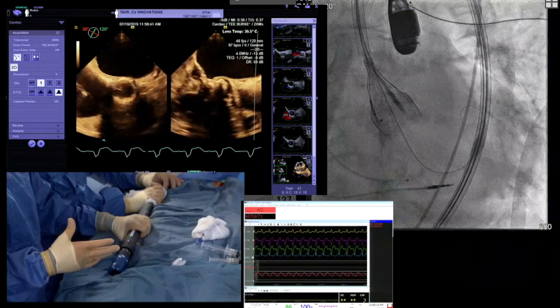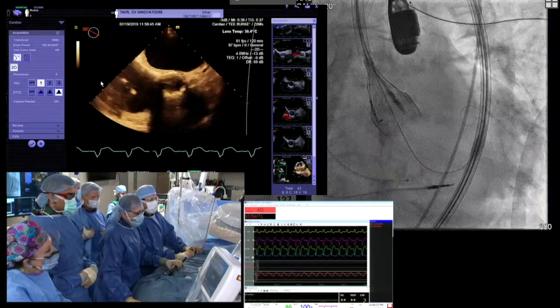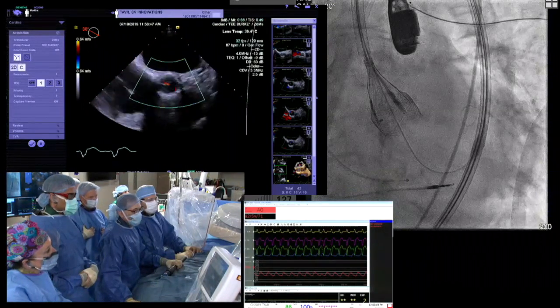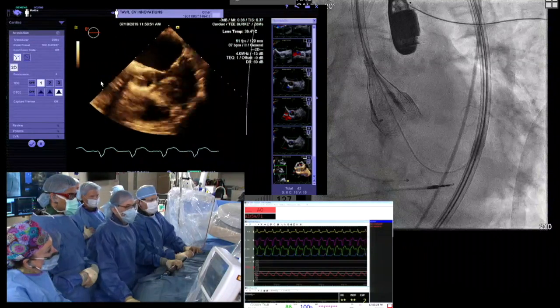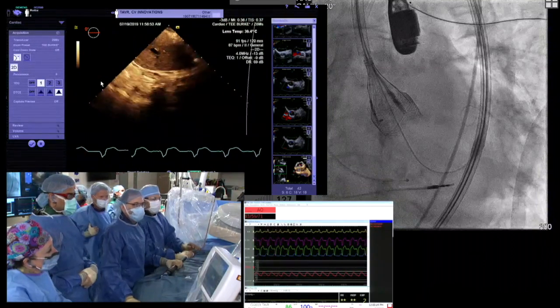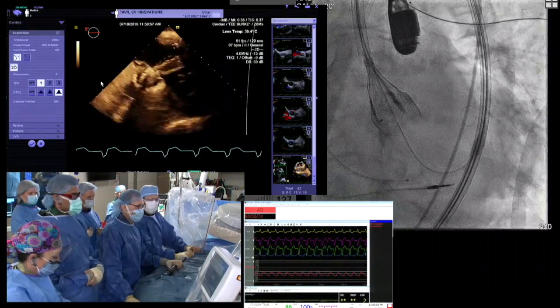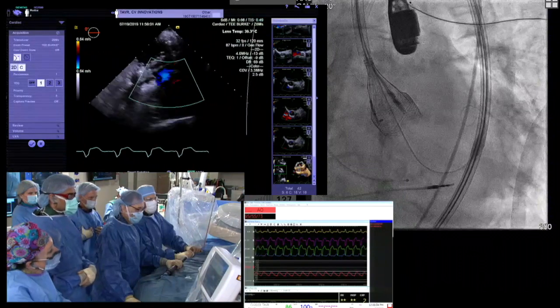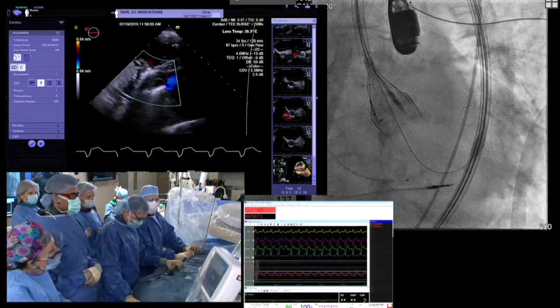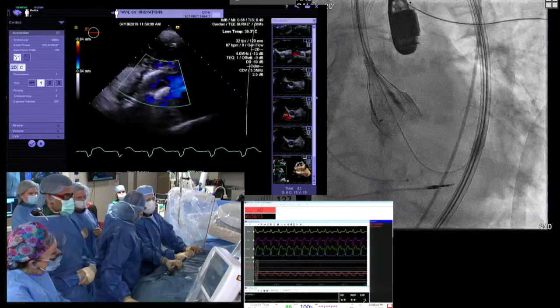And sometimes I'll go to a transgastric view just to see the jet, remembering that, again, you don't want to use the jet spray as an indication of severity. Bob, but please oblige the lady. While he's doing that, I just want to point out what Molly was saying about the curved, the preformed wire. It's just keeping our nose cone off of the ventricle there. We didn't use the wire at all. Really has no impact on the deployment ever.